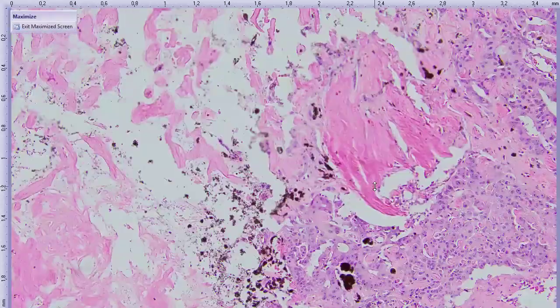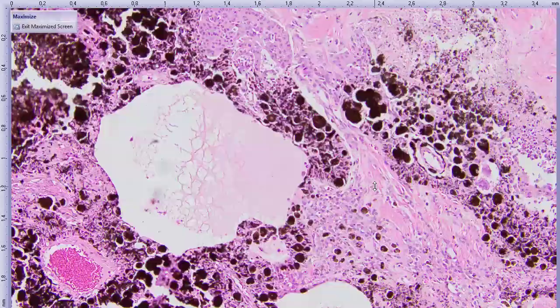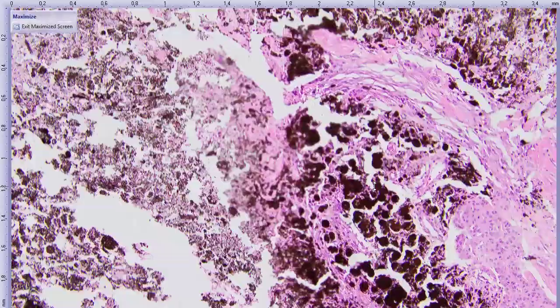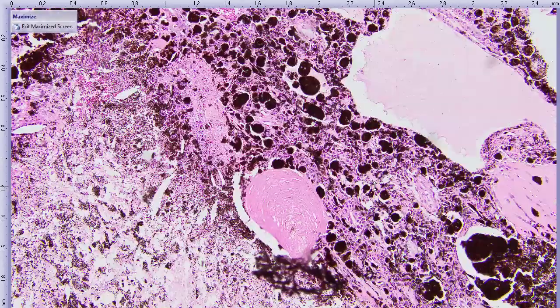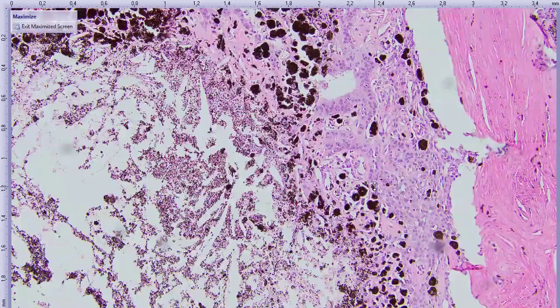And we keep moving, and there's an area where I hopefully will find, yeah, kind of right here, where I think it's more believable that we have a pigmented epithelial neoplasm right there. Right. So having a pigmented epithelial neoplasm is not that big of a leap in the eye. It's believable just because we have seen pigmented iridociliary adenomas or partially pigmented iridociliary adenomas.